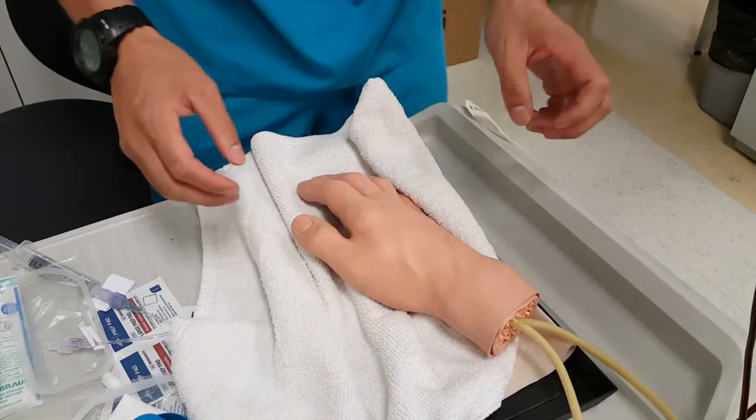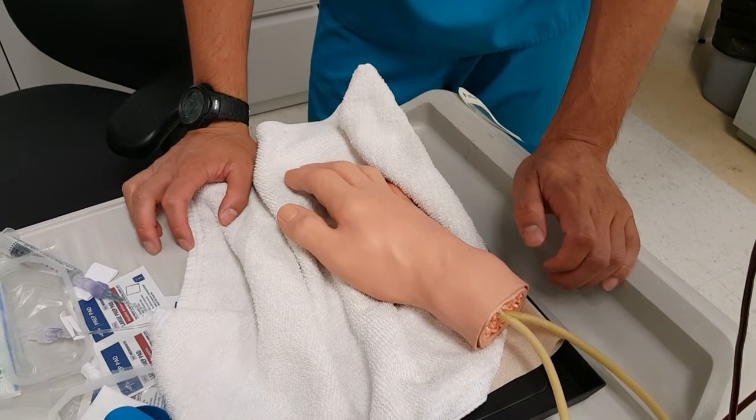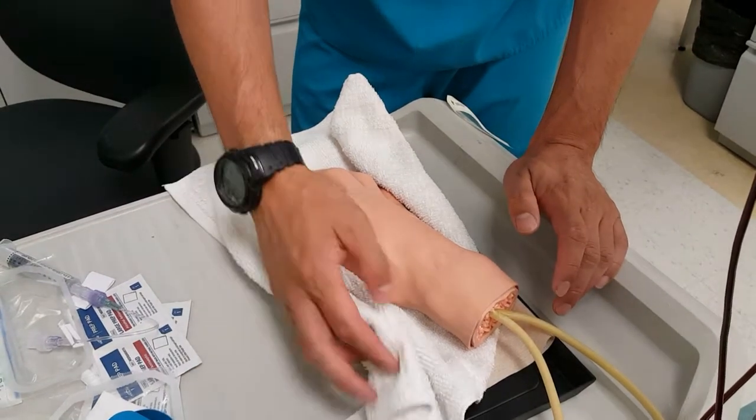The patient might ask you: is this going to hurt? I highly recommend not lying to the patient. You can tell them it's going to hurt a little bit or they might feel a pinch, but afterwards there should be no pain.